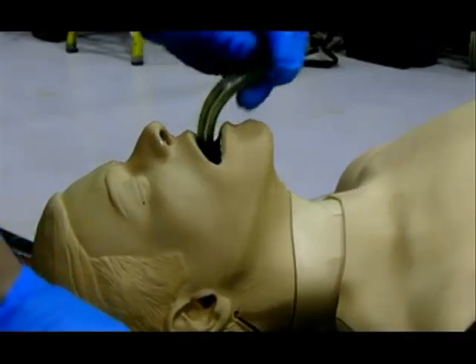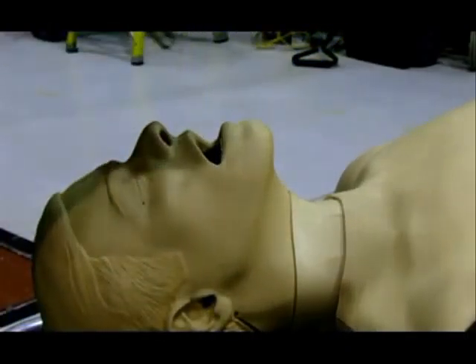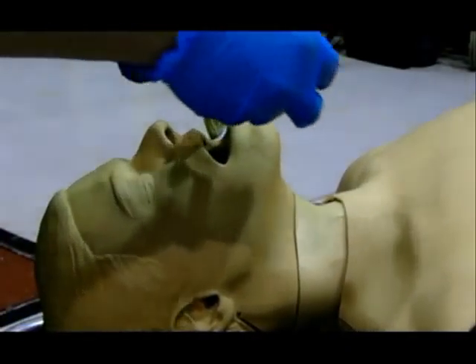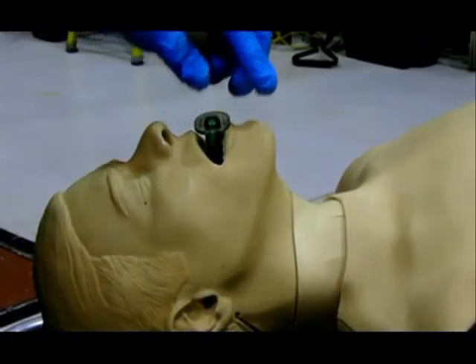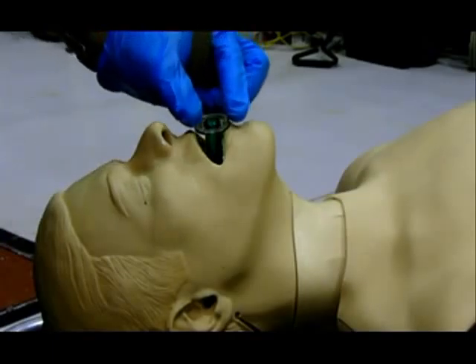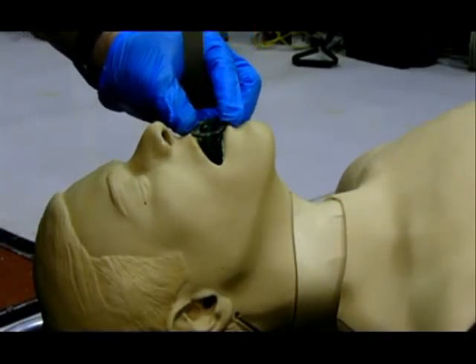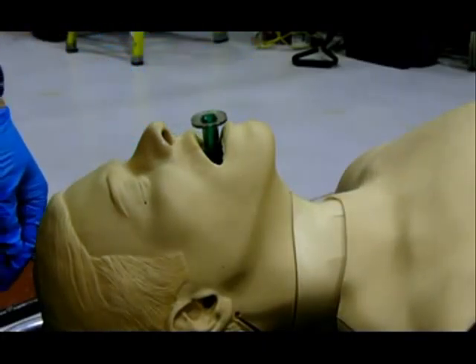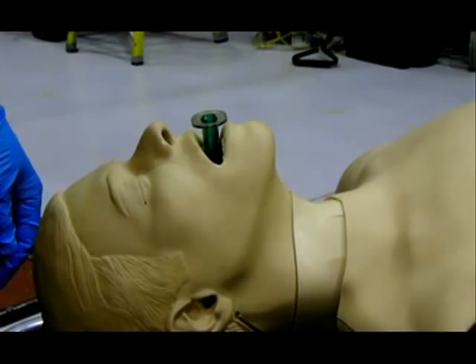With the third technique, hold the tongue forward with the tongue blade, hold open the airway in its normal position with the tip facing downward, and insert the OPA by gently sliding it over the tongue and into position, remembering the flange will rest on the outside of the lips. A pearl to remember is that if a patient accepts an OPA, you should prepare for advanced airway management such as endotracheal intubation, an LMA, a king tube, or a combi tube, or requesting an intercept from an ALS provider.